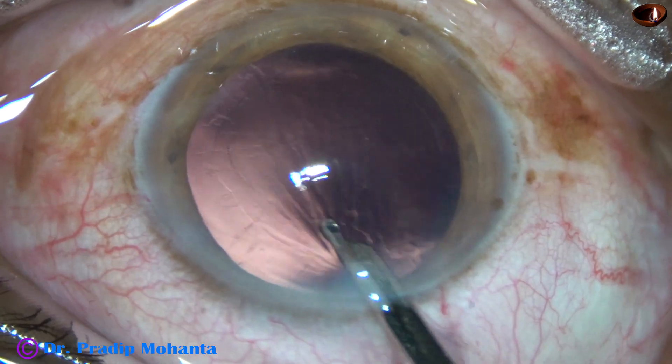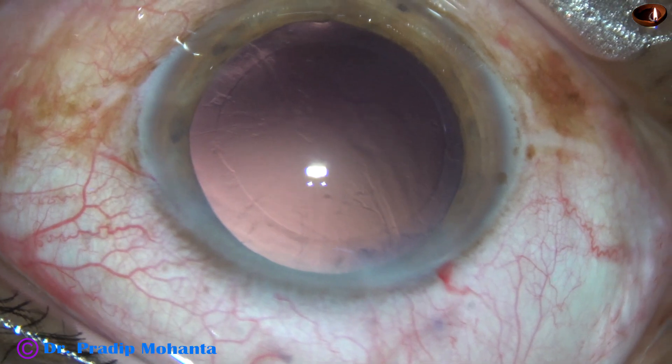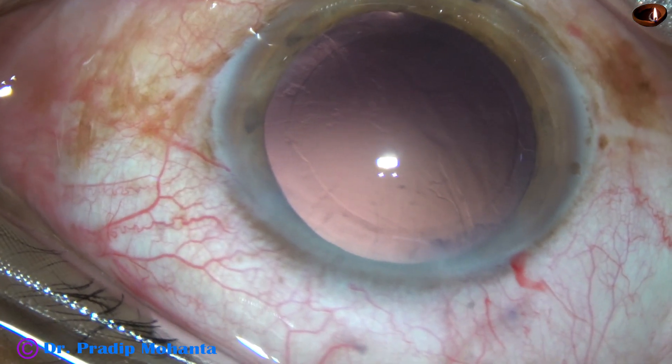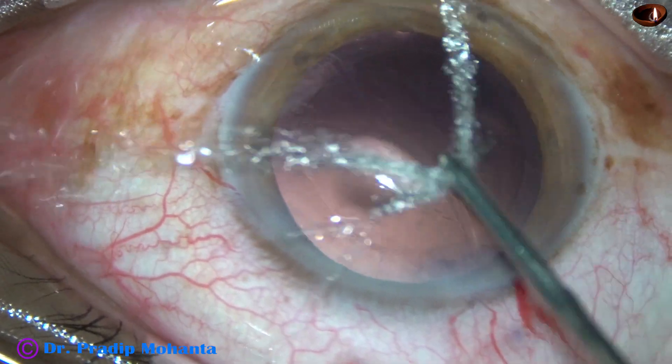And now, in this case, we have selected a hydrophilic acrylic intraocular lens. I am going to use a B cartridge to implant the lens.